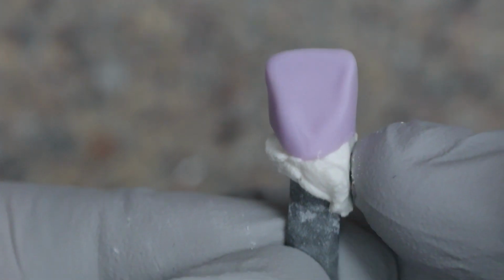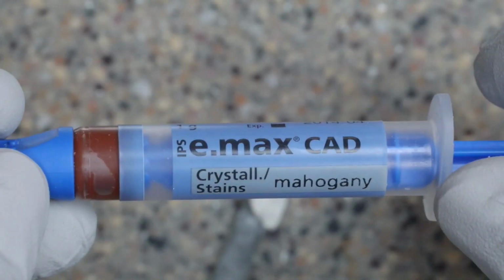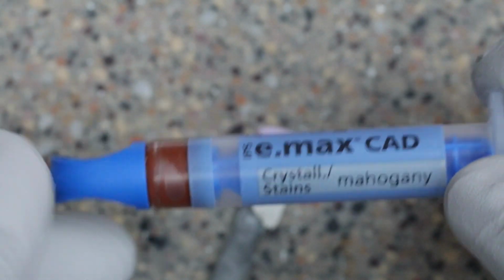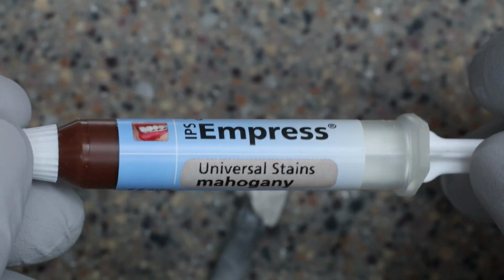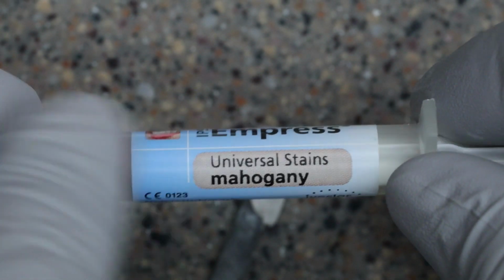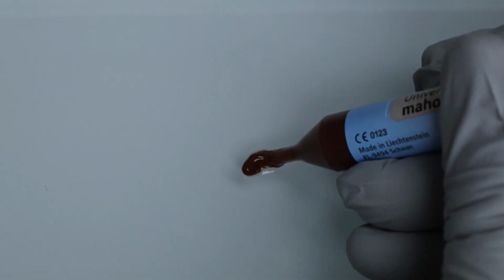Now you can use different types of stains to label the crown. I'm just going to write A3.5 on the back of here. And here I have an e.max CAD Crystal stain in mahogany. This one's a little older, so it's kind of set up and it really needs to be thrown out. Here I have an IPS Empress stain in mahogany, and I'm just going to use this because literally all I'm doing is just labeling the lingual of this. Just labeling it as A3.5 in this case.